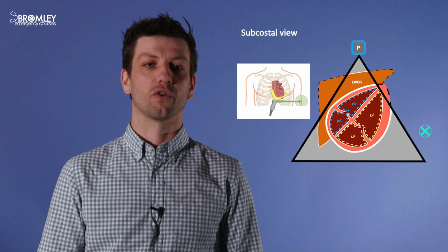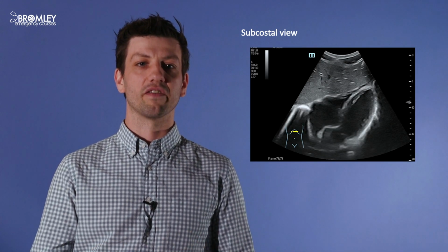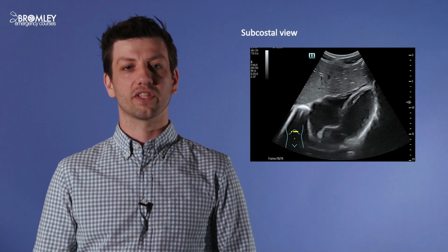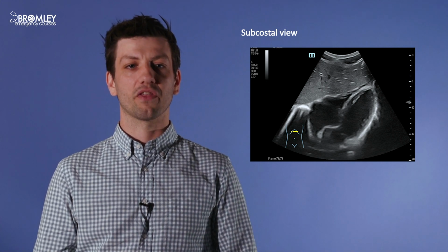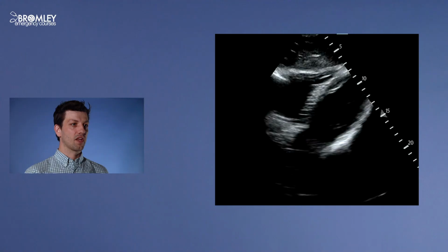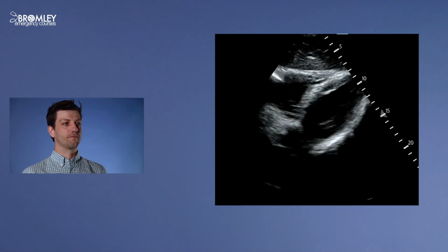This is a good view for looking for pericardial fluid. Here's a still image of the subcostal space, and at the top you see the liver, so we're using that liver as an acoustic window, and beneath it we're seeing a very small triangular shaped right ventricle, and beneath that, deeper in the image, we're seeing the left side of the heart. And here is a video of a subcostal view.